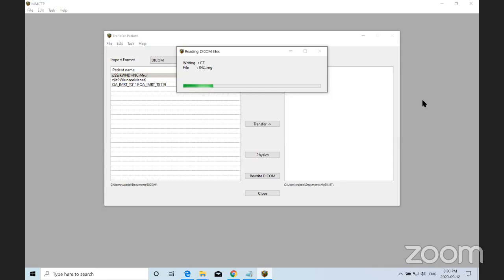No, it's currently not been coded to work with any brachytherapy calculation engine within EGSnrc. However, if you had a brachytherapy DICOM RT plan, you would be able to import the dose and the structures and CT images or MR images. I'm not too confident that ultrasound would work. I don't think the ultrasound images would import properly.